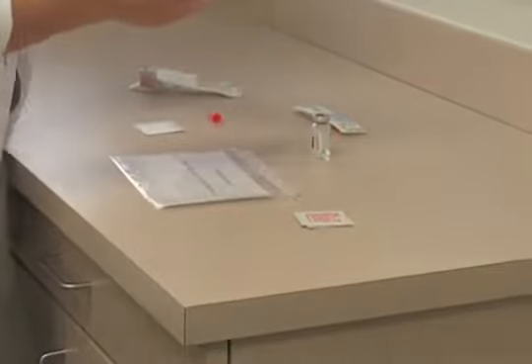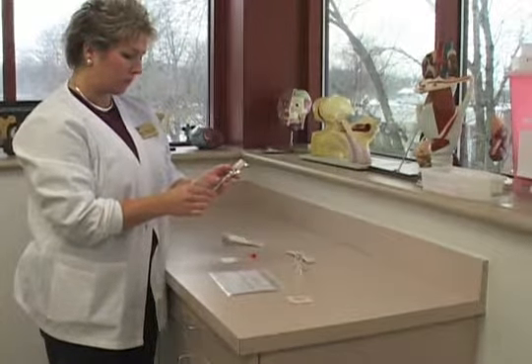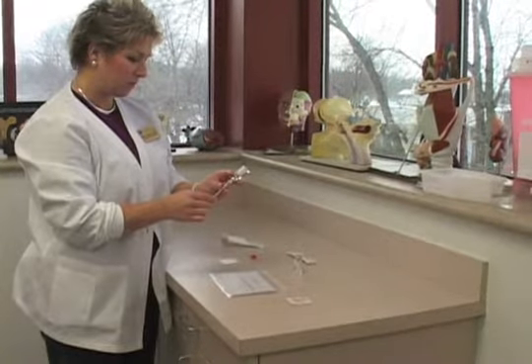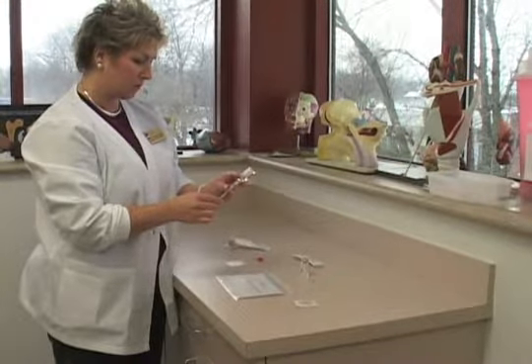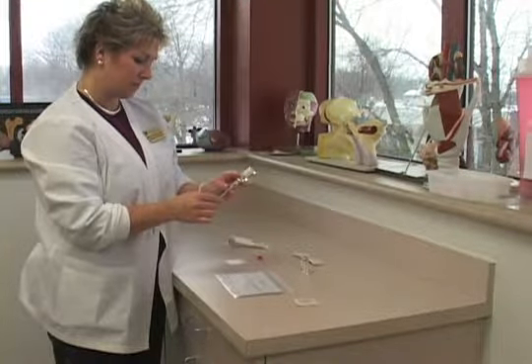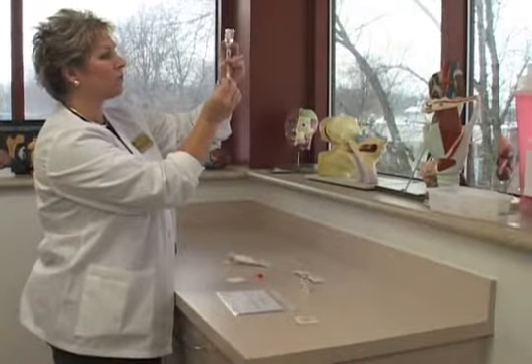It is acceptable to draw up the air volume separately. Draw up air equivalent to the cloudy insulin dose, inject all the air into the cloudy vial, and then you would draw up the air equivalent to the clear insulin dose and inject all the air into the clear insulin vial. Invert the vial of clear insulin and withdraw amount prescribed.